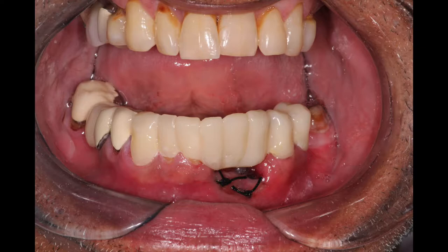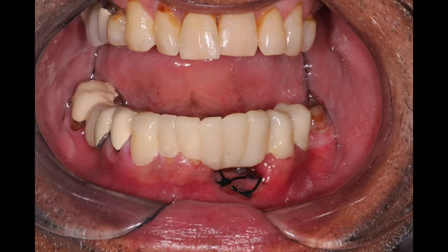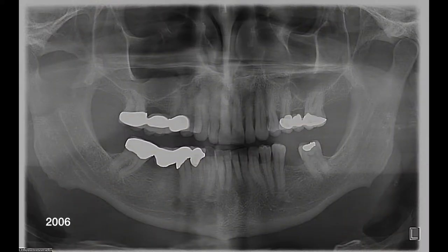Hello, welcome to this video. In this video we're going to be looking at this individual who ended up having to get a long span temporary bridge after the removal of his front three teeth, numbers 22 through 24, and our site preparation using curettes and rinses during that process.